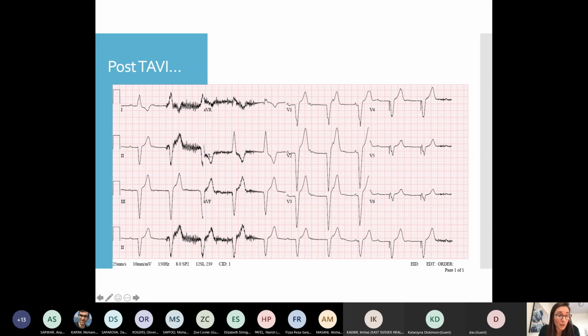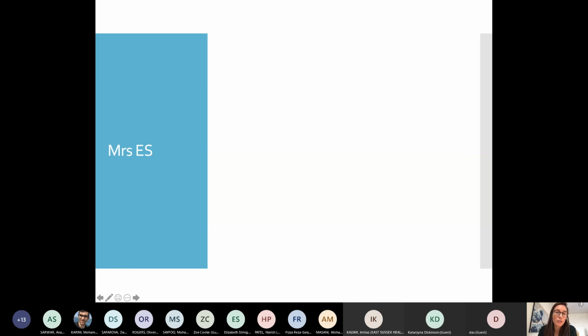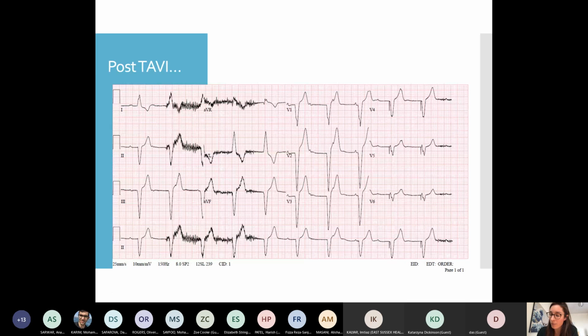So yeah, sorry, the atrial activity is independent of the ventricular activity. So P wave, swallowed up P wave, another P wave, and you can see the QRS is very broad because it's coming from the ventricles where this temporary wire is. And some of these settle with time. That one didn't, so he required a pacemaker.